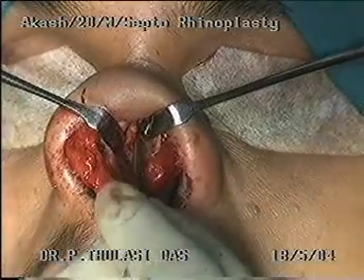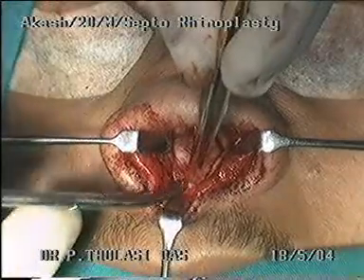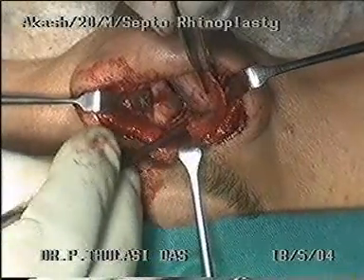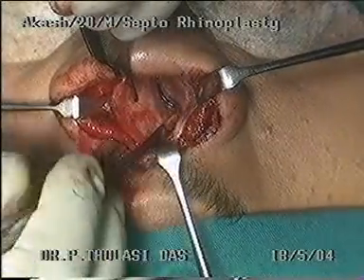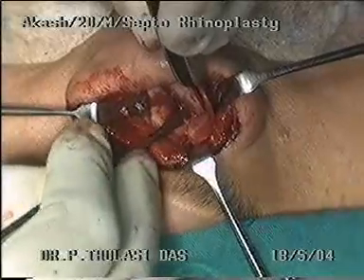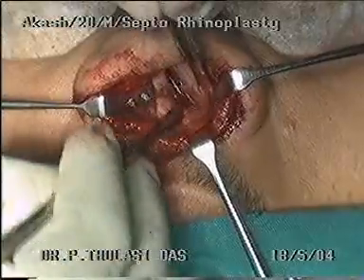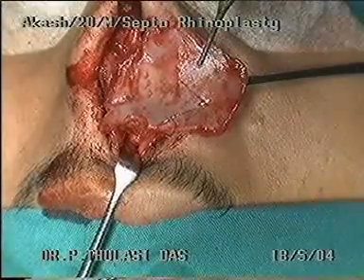The septal cartilage is dislocated from the perpendicular plate of the ethmoid bone. The cartilage is released from its attachments to the maxillary crest. The buckled septal cartilage and the angulation it makes can be appreciated now. The cartilage is then released from the vomer and removed in toto.